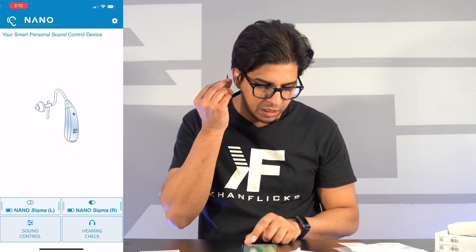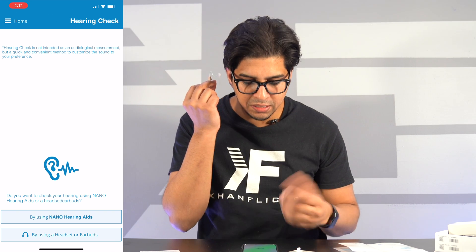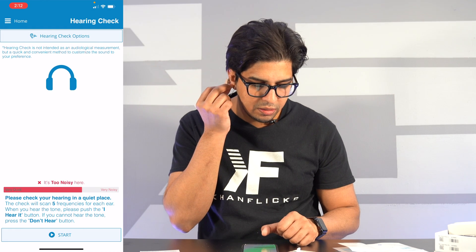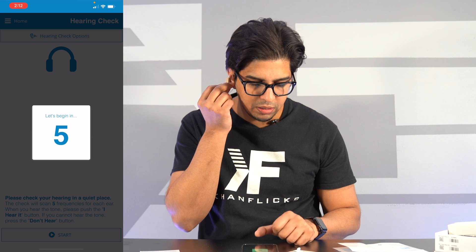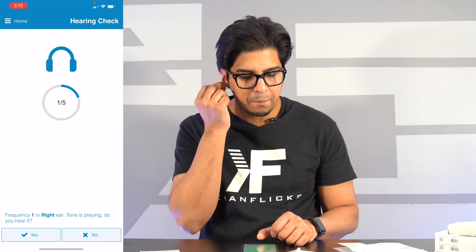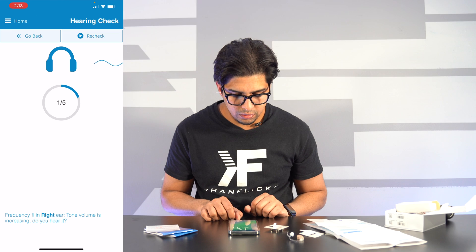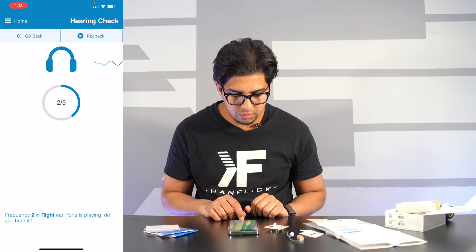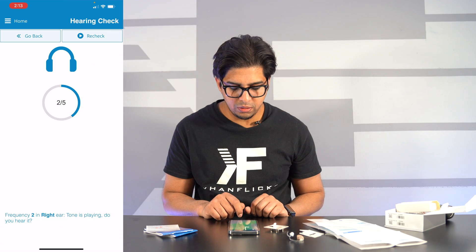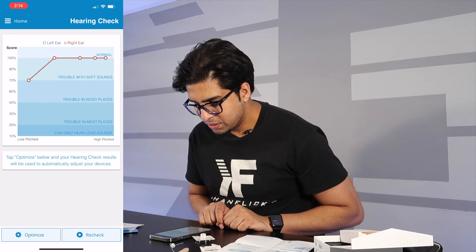On the right one, I can hit 'Hearing Check,' which allows you to conduct a hearing test — which is kind of cool. I'm going to hit 'Microphone' and 'Testing Start.' Let's begin. I don't hear that tone... okay, now I hear the tone... I don't hear that tone — this is weird... okay, now I can hear that frequency. But I couldn't hear the first frequency — that's interesting.